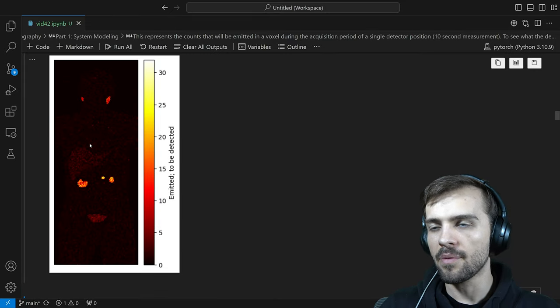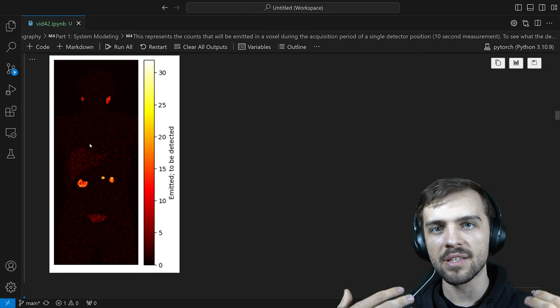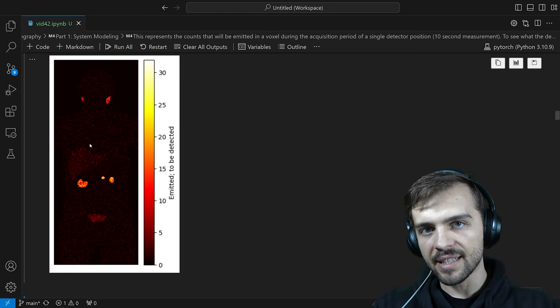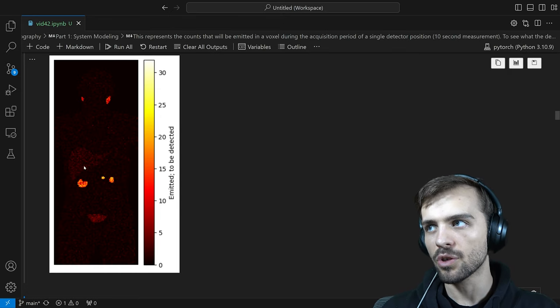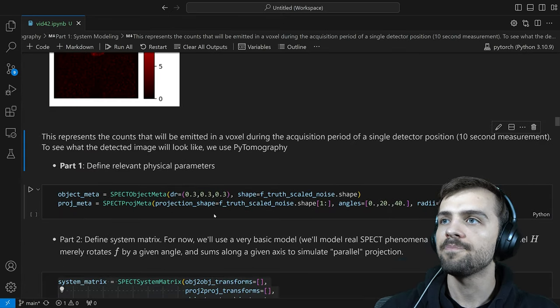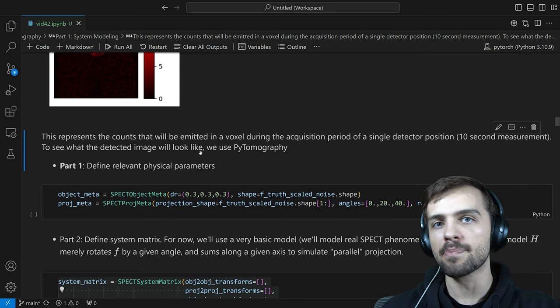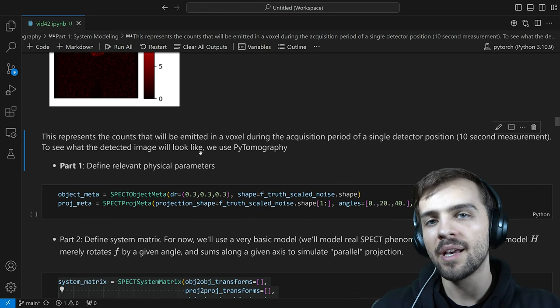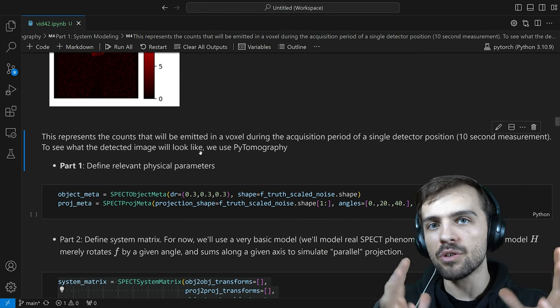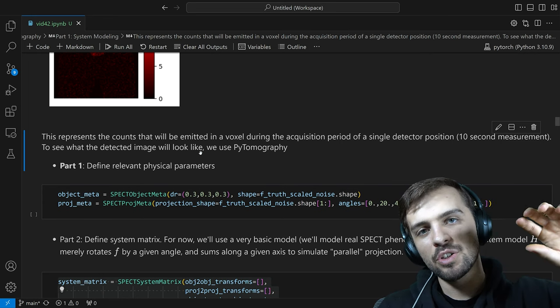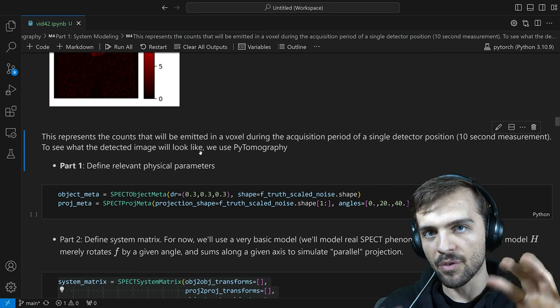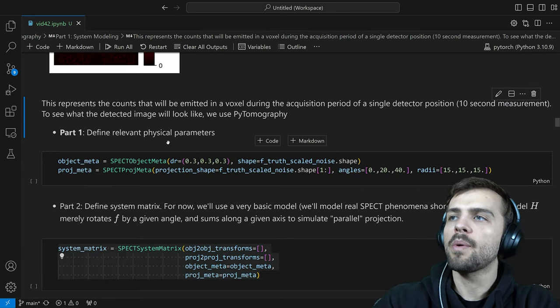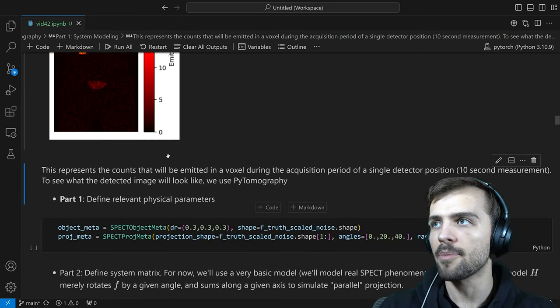We've simulated the 3D distribution in space — the number of photons expected to be detected. We haven't talked about G yet. In order to get G, we're going to use PyTomography. PyTomography needs system modeling — we need to go from F to G, because that functionality will be used in reconstruction algorithms to eventually go from G to F. The first thing is to define all the relevant physical parameters of our system.